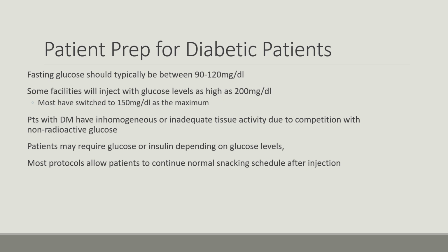Some patients may require glucose or insulin depending on their glucose levels. Most protocols allow patients to continue normal snacking schedule after they're injected.